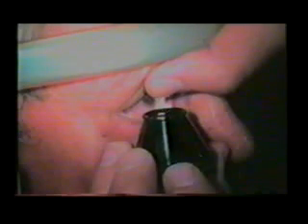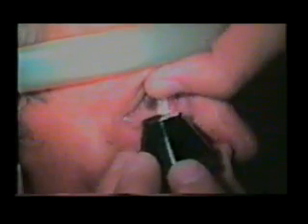Now we pull the lids to open. We use the edge of the lens to support the lower lid margin. With the other finger we pull the upper lid, and gradually we apply the lens and let the upper lid come down. So this is how, again: fill the cavity, open the lids, use the lens to support the lower lid margin.